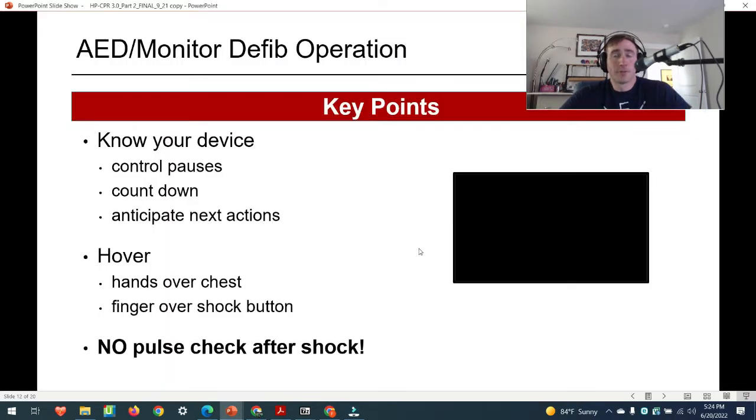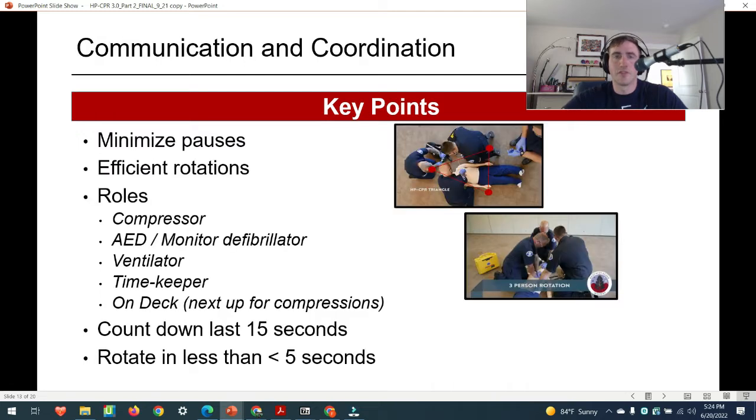So it's pretty straightforward if we could just do that every single time. Not a big deal, right? Now, it looks like there was a bit of a lag from when they stopped CPR to when they defibrillated. That's the pre-shock pause. And it was because the CPR artifact was still on the screen. Once that stopped, they saw the VFib. But we have see-through CPR, so we could kind of anticipate that maybe a little bit more than they could.